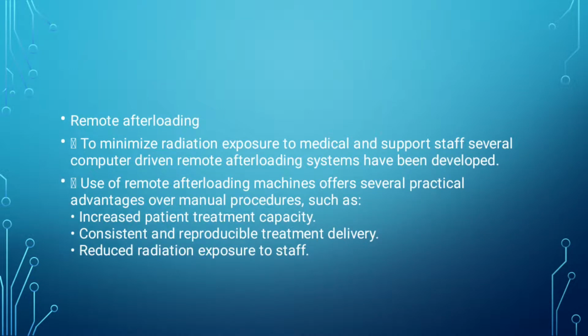Remote afterloading is used to minimize radiation exposure to medical and support staff. Several computer-driven remote afterloading systems have been developed. Use of remote afterloading machines offers several practical advantages over manual procedures, such as increased patient treatment capacity, consistent and reproducible treatment delivery, and reduced radiation exposure to staff.